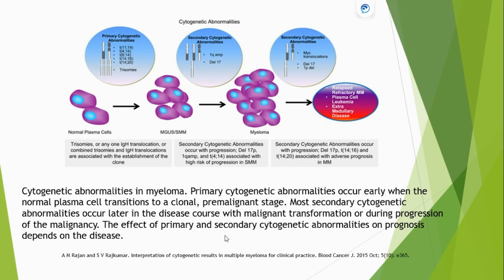Instead of trisomy, I'm using hyperdiploidy. Hyperdiploidy means any count over 46, which is the normal count of our chromosomes. And then, of course, the majority of the hyperdiploid cells in myeloma are composed of trisomies, meaning one extra copy of some of the chromosomes, which are usually odd-numbered chromosomes. But you could see tetrasomy, pentasomy, and all could fall into hyperdiploidy. So I'm using a broader terminology, hyperdiploidy.